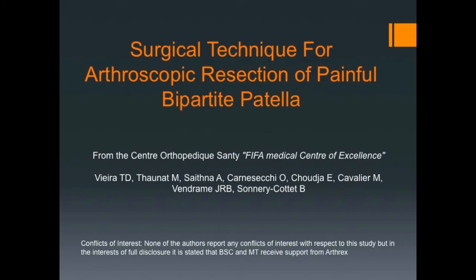Standard anterolateral and anteromedial portals are utilised. Viewing is performed through the anteromedial portal and instrumentation through the anterolateral portal.